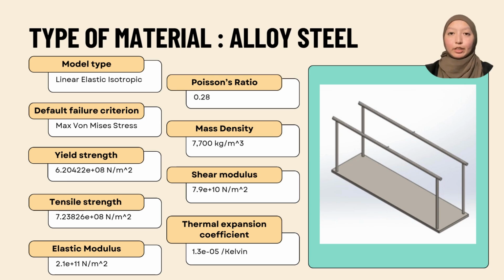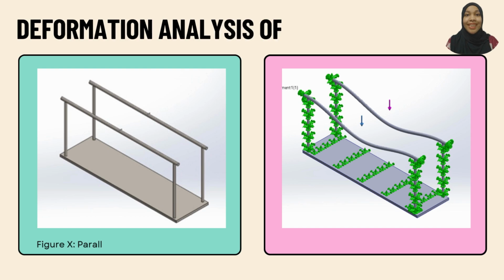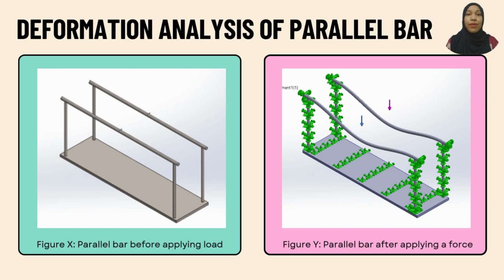The type of material used is alloy steel. These are the properties of the material. Here, you can see the parallel bar before and after applying the load. The visual shows how the structure deforms slightly when force is applied, simulating the real-life pressure from a user.